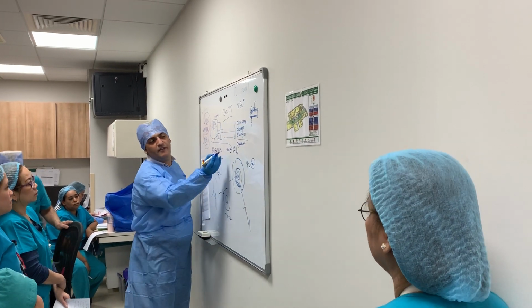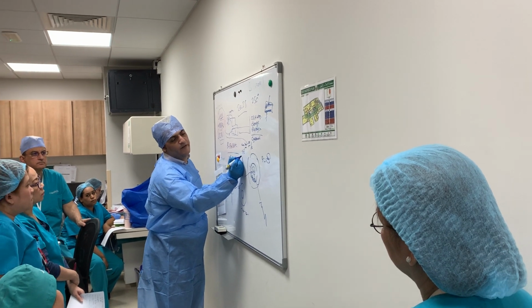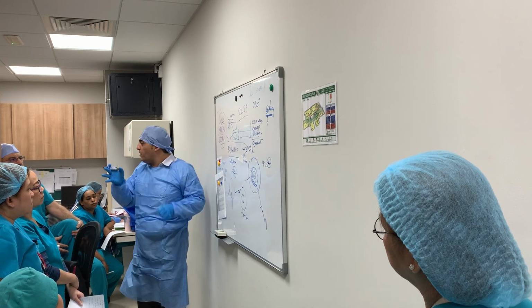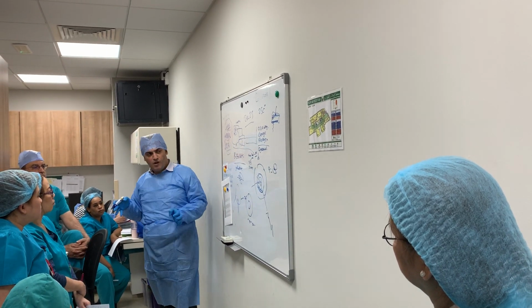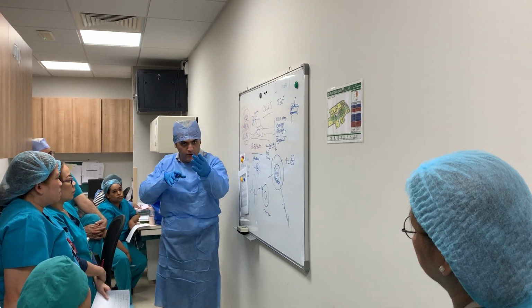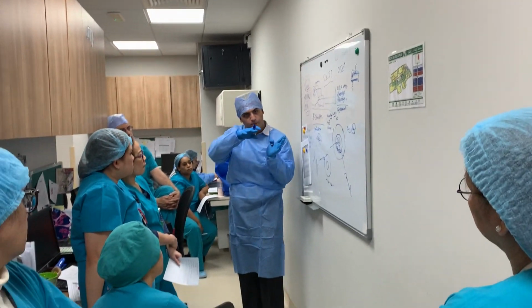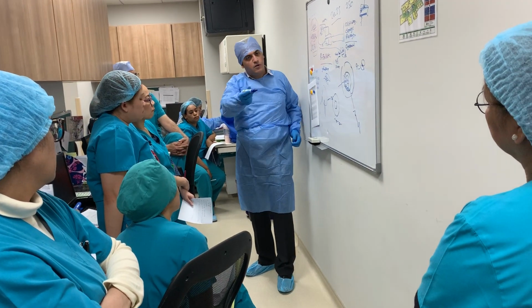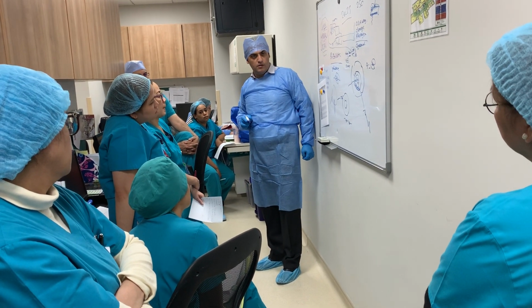Because 50 microliters could be within the range of 125 or 200 micrograms. So we're dealing with micrograms here versus a million sperm. This is why I told you to use 10 million and then reduce it to 500 or 300 microliters, because in that case you have around 5 million, which is adequate to the concentration that you are about to use. Okay, all right.